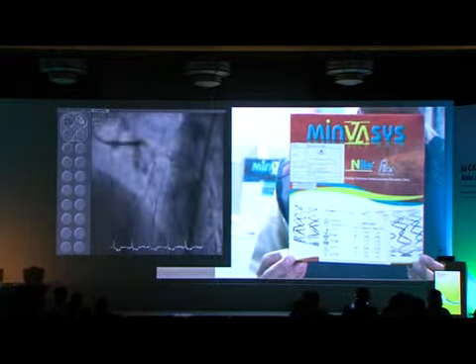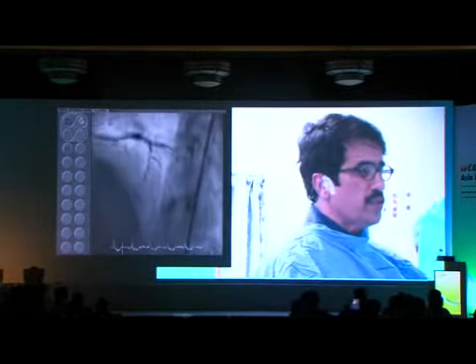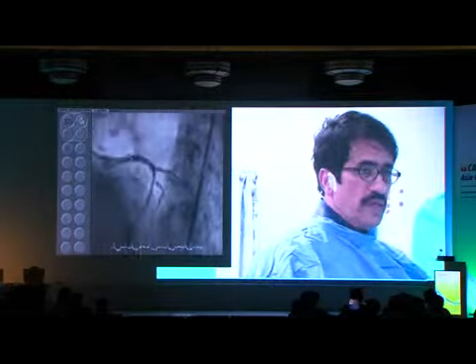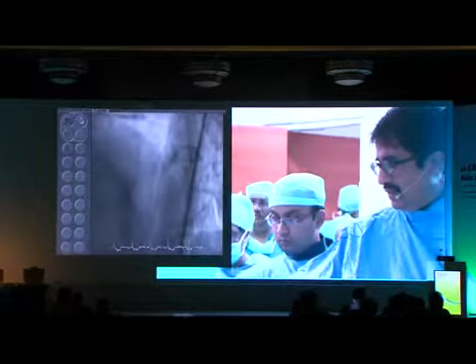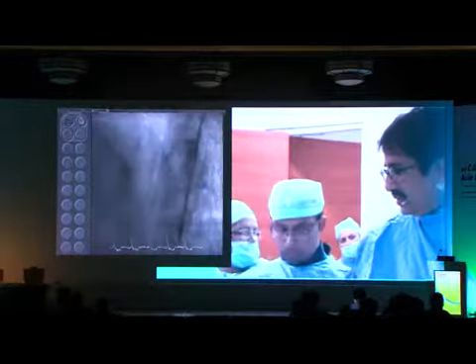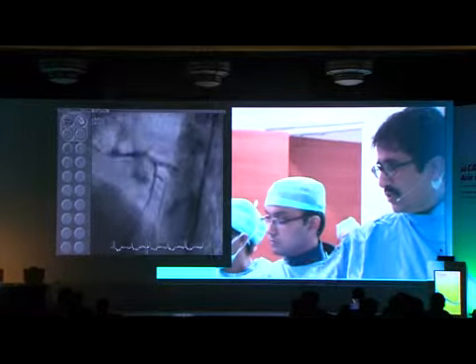We have to understand, can somebody show the animation there in the hall? In the meantime, this is a bifurcation stent. Can you bring it here? Just hold it in front of the camera.